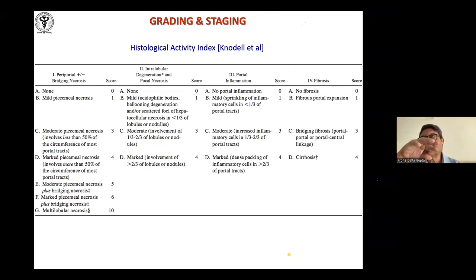You can get inflammatory cells confined to the portal tract. It can go and cause interface hepatitis or piecemeal necrosis, or you can find inflammatory cells within the lobule. Either single cells will get necrosed, spotty necrosis, or groups of cells, when it is confluent necrosis.